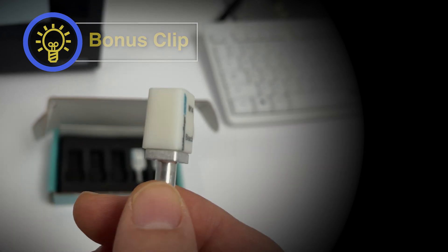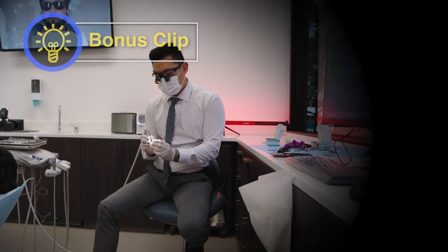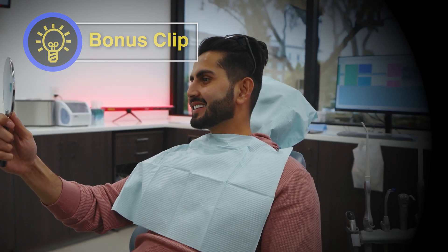And then we mill these out in camouflage. This is a camouflage bleach shade. We have one bleach shade that is super white, but it actually matched his lower hypoplasia appearance teeth really, really well.